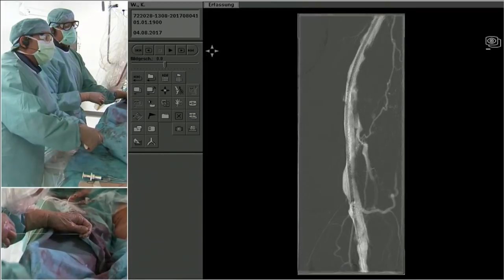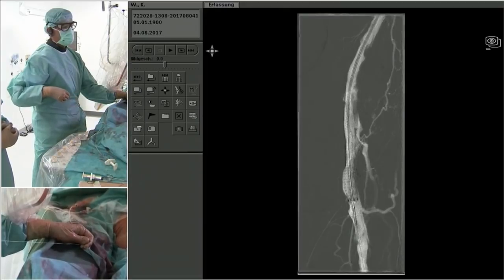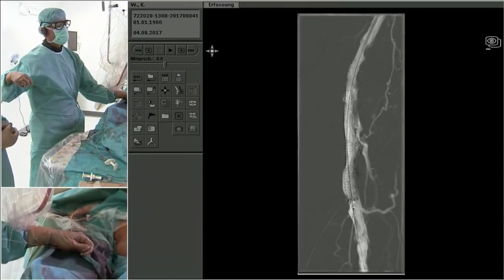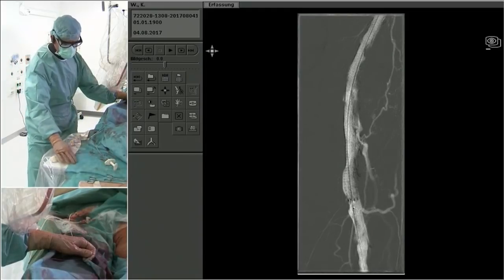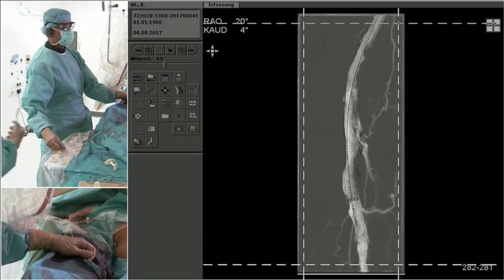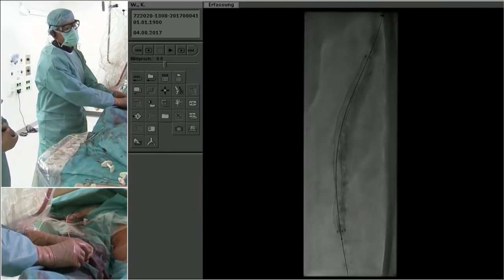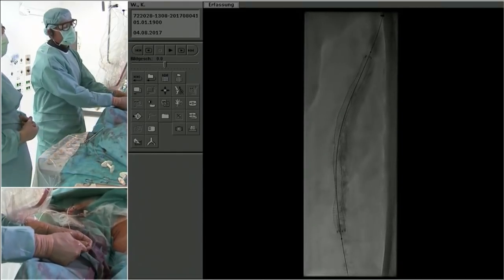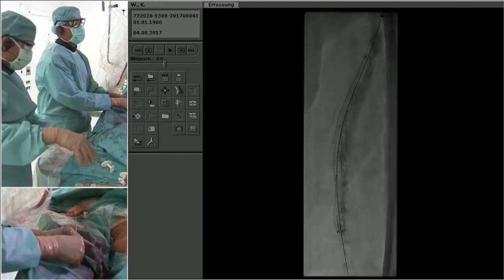Subhash, many times we teach to go from normal to normal vessel. In a diseased vessel diffusely like this, there's really no normal to normal. Yeah, and as I said, this technique, crack and pave, is usually a combination technique where we then either take a Supera stent a little further down, or a drug-coated balloon, or a drug-eluting stent, or whatever.